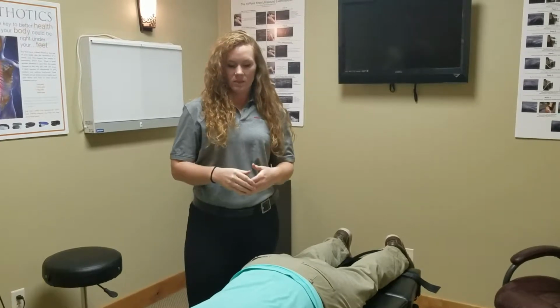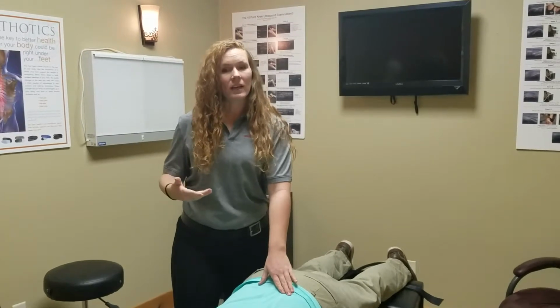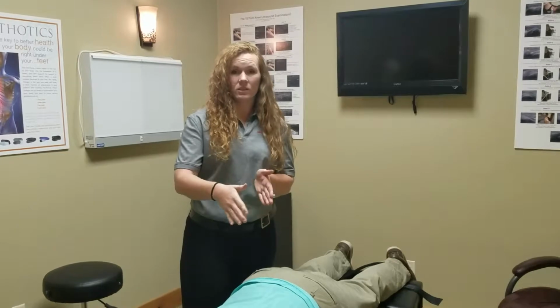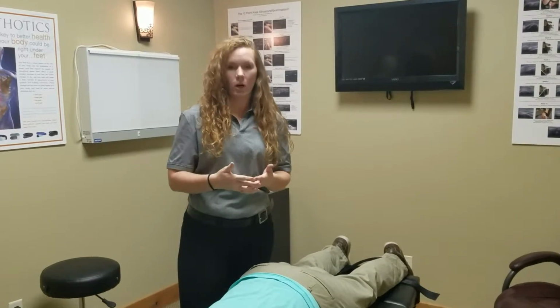And what that is for and why we do this technique in the office is to help anyone with a hot low back, or a disc that may be herniated. What this technique does is it opens up that spacing in the intradiscal space and allows that nerve flow, that spinal compression, to open up and take pressure off.